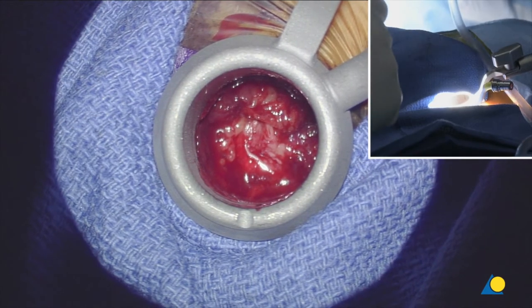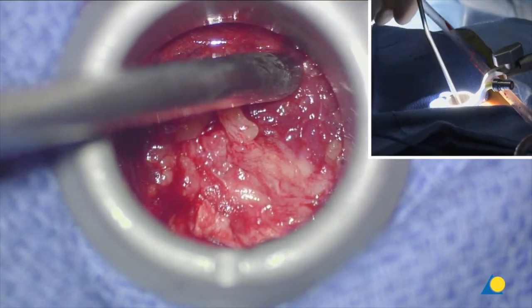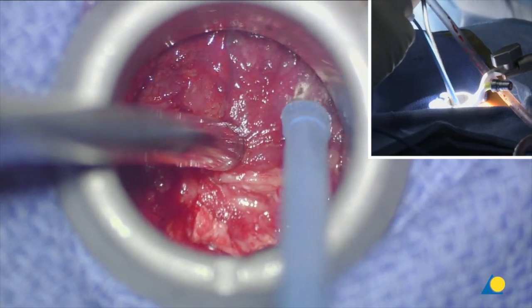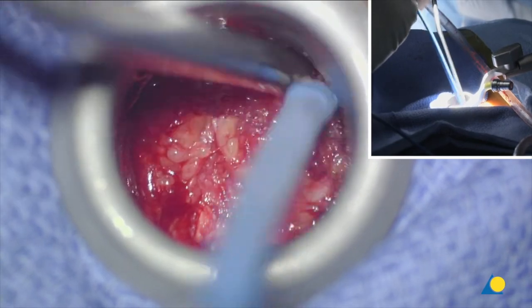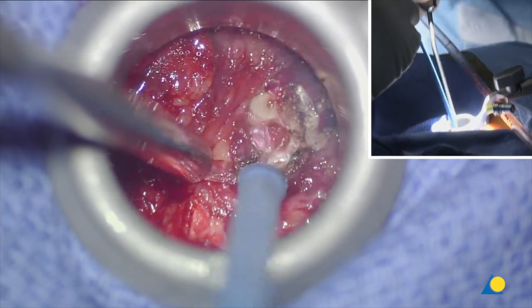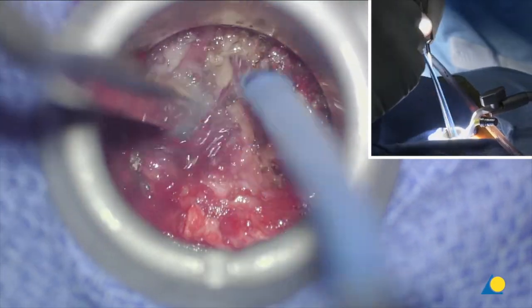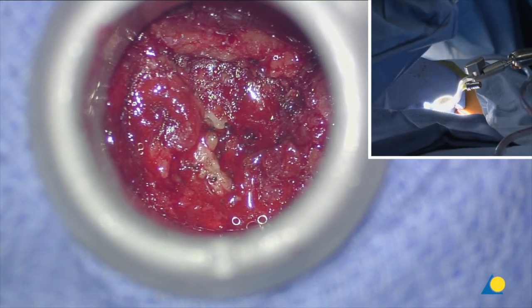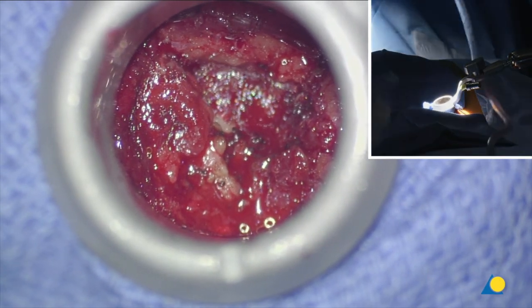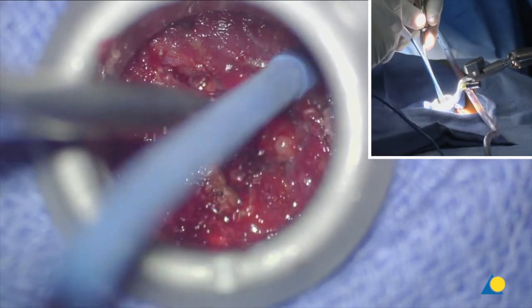Now we're looking at the facet joint. What I want to do first is identify the L4 lamina immediately — and it's right there. That's the facet joint. I don't want to go too far lateral because I don't want to manipulate the facet joint. We rotate a little bit medial in order to get the angle towards the lamina and the base of the spinous process.